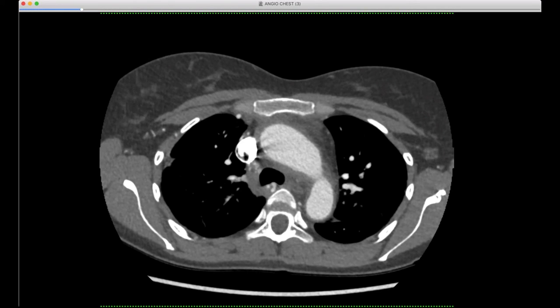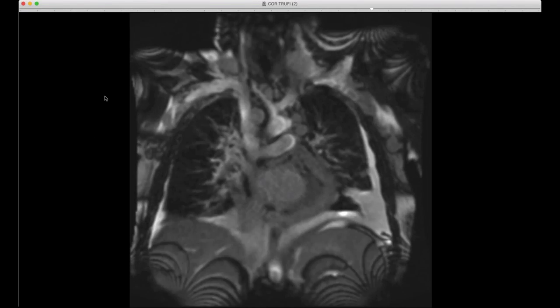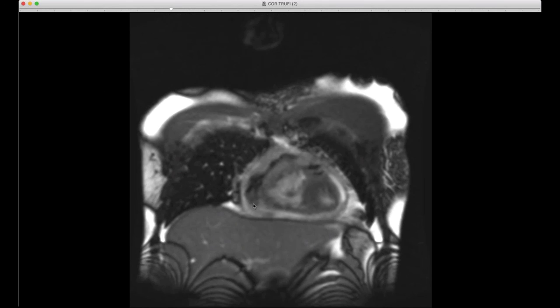Maybe I'll show one more case. This was another really good case, also that Art showed me. This was a young patient who came in with a cough and some chest discomfort. Can you see the screen now? Good. On the coronal MR, there's what looks like circumferential pericardial thickening. There's pericardial effusion. This is T2-weighted. There are also pleural effusions bilaterally. The pericardium is very nodular and very thick. There are some enlarged lymph nodes in the mediastinum.